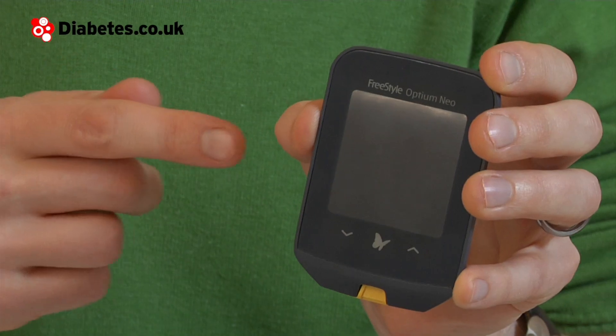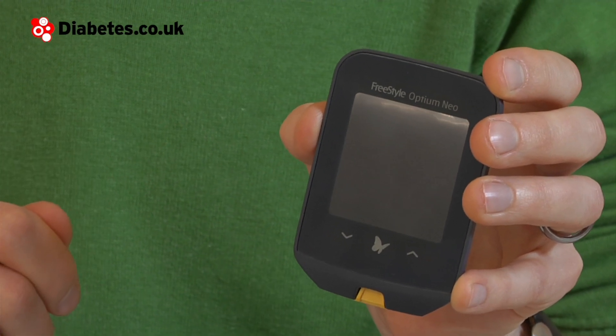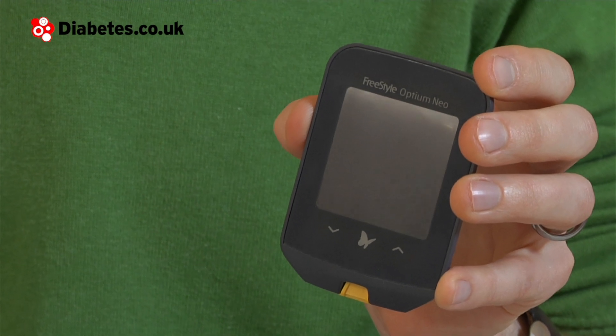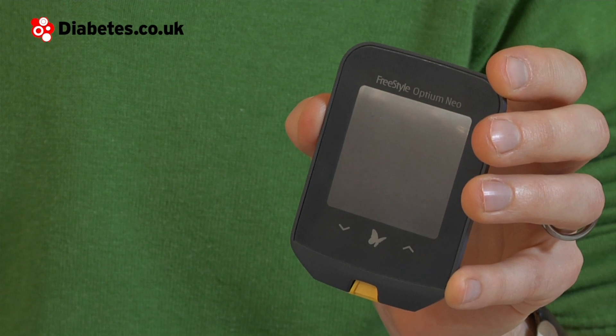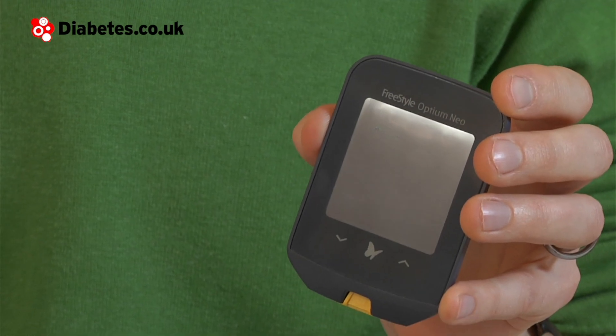These include a touch screen, takes blood glucose and blood ketone results, insulin dose logging, highlights low and high sugar level trends and provides insulin dose suggestions. You'll notice as I go through the reviews that the Optium Neo uses a combination of buttons and touch screen technology.